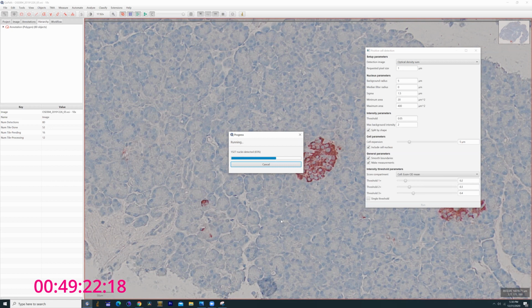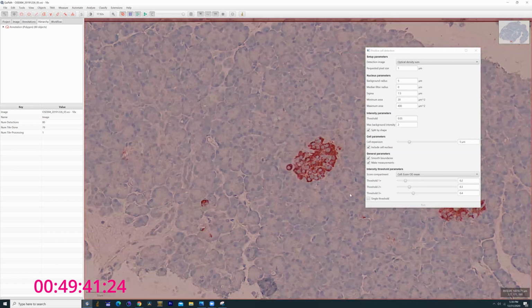So essentially doing what this does already, but without the advantages of having the metadata for the surface area pre-embedded, using a downscaled image, and also unable to track the artifacts back to the original image, because these are simply masks on top of masks, or masks on top of original images, as opposed to this where you can actually reference each individual cell within the count. So if there's any questions about a given event, it becomes nearly impossible to reference it again.